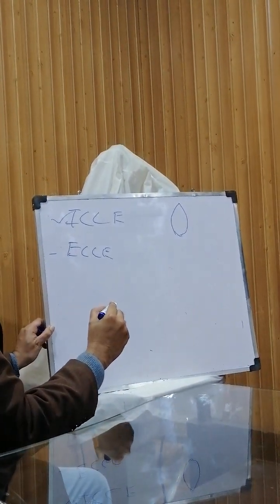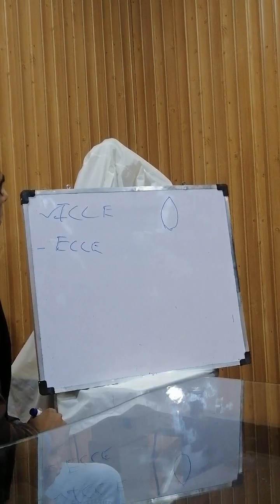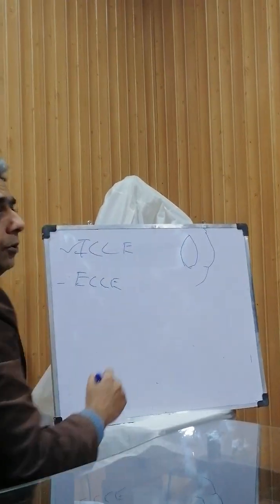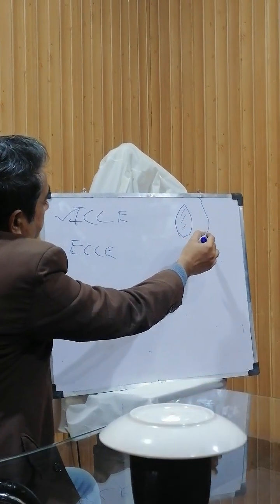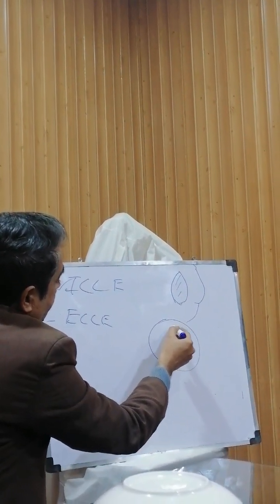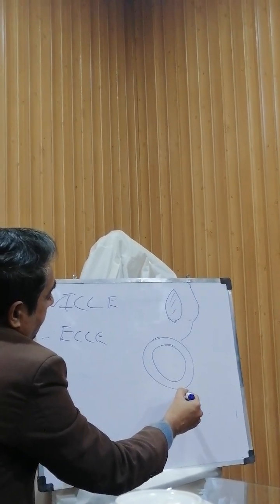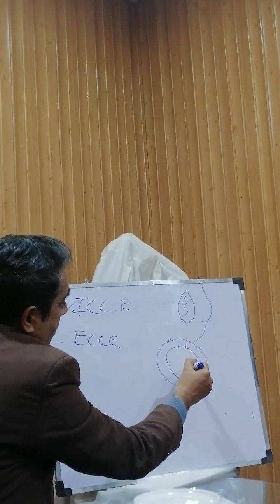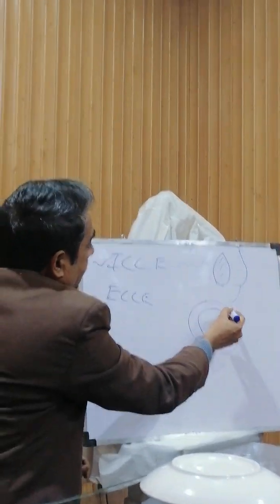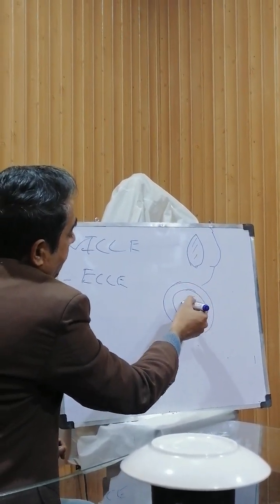Almost two decades ago, maybe, or some more years back, this is the lens, and what the eye specialist used to do, the opacified cataract after giving the incision. This is the limbus, this is the dilated pupil, this is 12 o'clock position. Are you getting my point? This is the picture which is being taken from the microscope, and you are seeing this eye, and this is an enlarged image. This is the limbus, this is the dilated pupil, and this is the cataract.